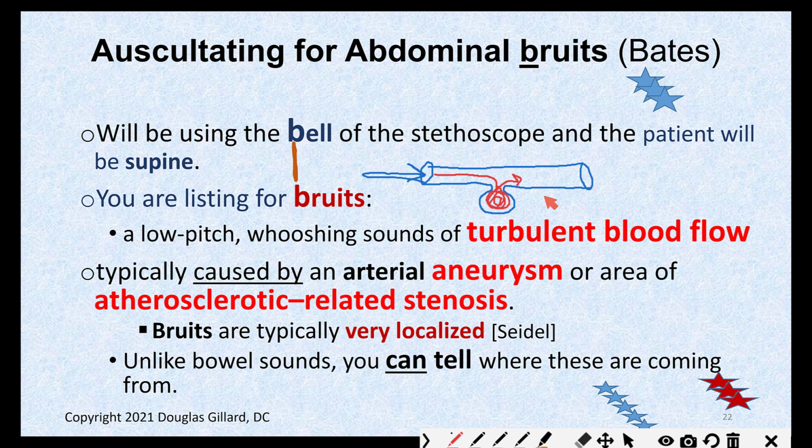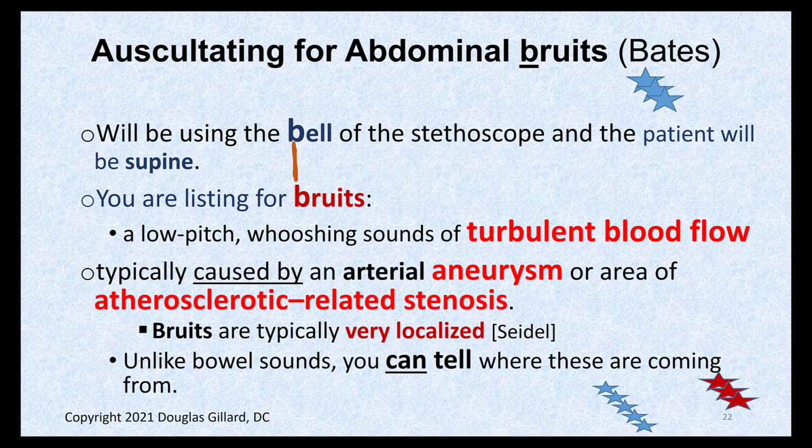And if you happen to put your stethoscope here on the skin and listen, you can hear that whoosh, whoosh, especially in systole, when the pressures get really high. So it could be upstream. If you put the stethoscope here, you probably would hear it as well. If you put the stethoscope right over the top, you would definitely hear it. If you put the stethoscope way down here somewhere, you're not going to hear it. So you have to be fairly close to it. So that's what we're looking for.